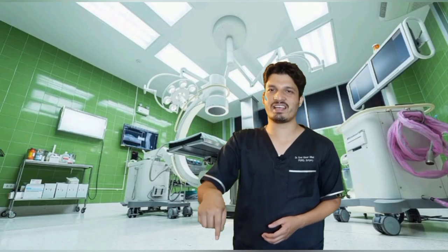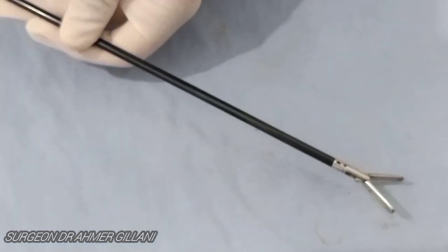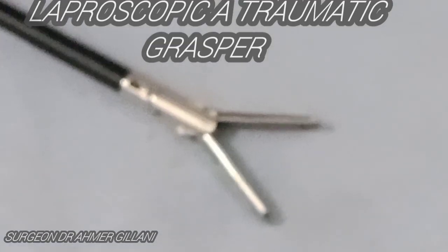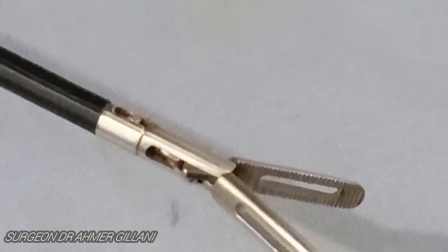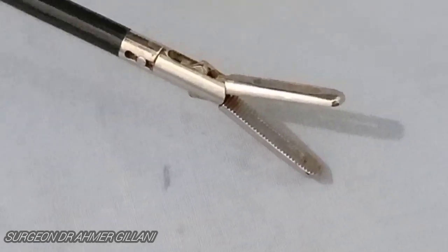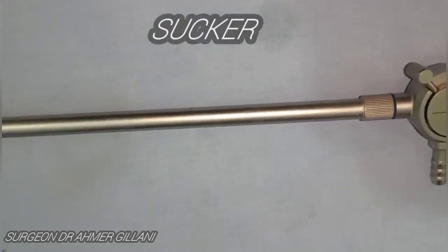The next instrument on the screen is the laparoscopic fenestrated grasper. You are seeing the fenestration — the hole — in the close-up view. It is the non-traumatic grasper which is used for grasping various tissues in laparoscopy. In the zoomed-out view, you can see it has a hole and serrations.